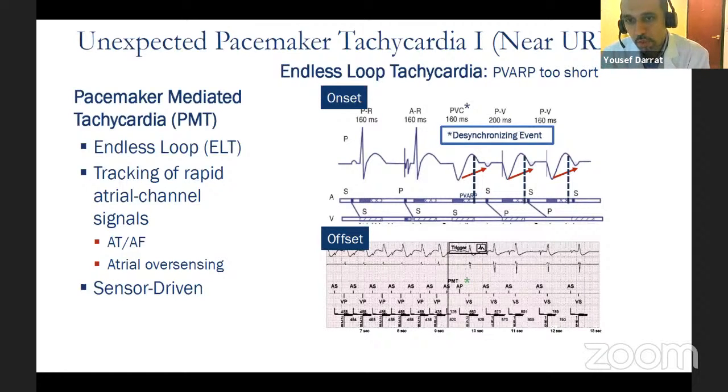For example, like you mentioned, there's someone who comes in complete heart block, just revascularized, needs a pacemaker, and his EF is 30%. You would just go ahead and put an ICD. The guidelines or that paper does say that it's reasonable to put an ICD because you don't know if it's going to recover. I mean, the patient had an anterior wall MI. Well, is he going to recover or not? You can put an ICD.